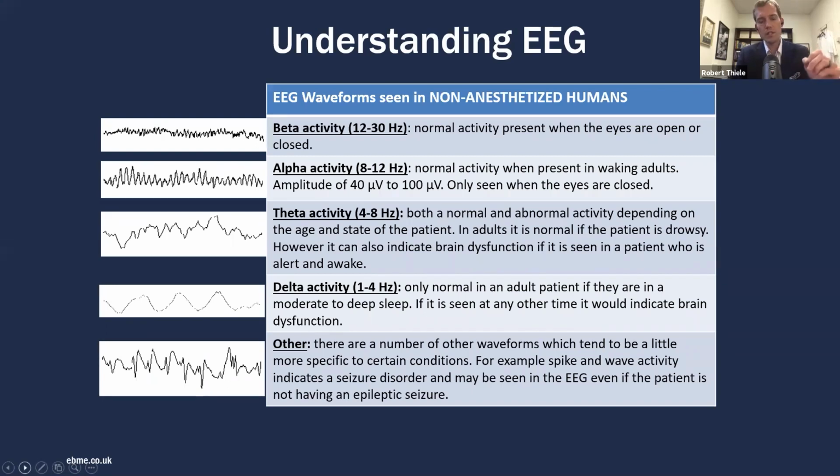So if you look at these changes in electrical activity that occur during different states in non-anesthetized humans, you can start to see patterns. And so on the left, and we'll talk about frequency analysis a little bit later, in an awake person, you see an EEG waveform that looks like this top left figure, and that's called beta activity. These sort of peaks and troughs are moving at about 12 to 30 hertz in an awake, healthy individual. If you close your eyes, you get less stimulus and you develop different EEG waveforms. And this is what's called alpha activity.